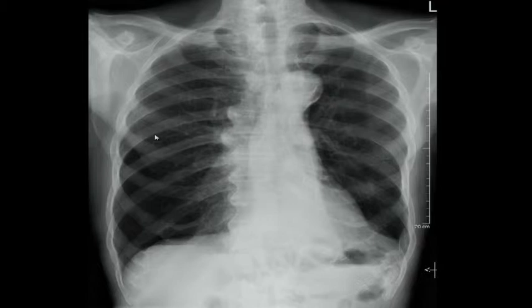This area is lucent, more lucent compared to the rest. But that's normal. As you come down, the volume of the lungs goes larger, and the lower lobes are more lucent than the upper lobes, right? That is the whole thing when you do a lateral chest X-ray, right?